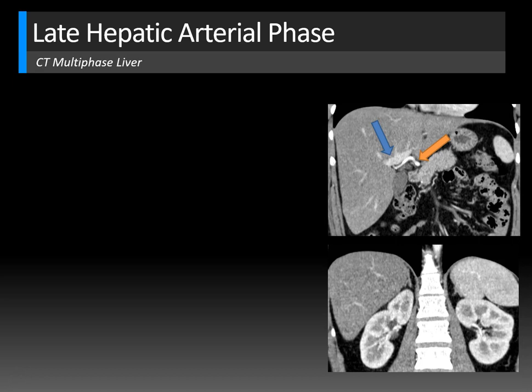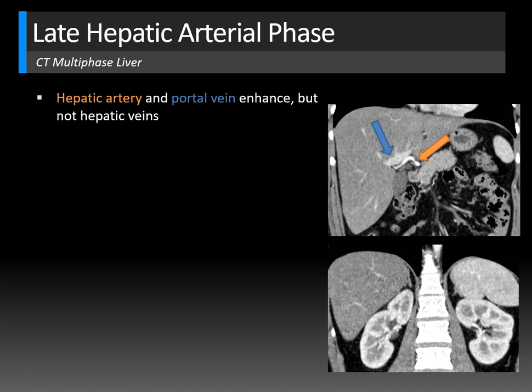On the late hepatic arterial phase, you should see the hepatic artery and the portal vein enhance, but not the hepatic veins — and you can see those structures denoted by the arrows. If you don't see any portal vein enhancement — meaning you only see the hepatic artery — you've scanned too early. And if you see the hepatic veins enhancing, then you're too late.